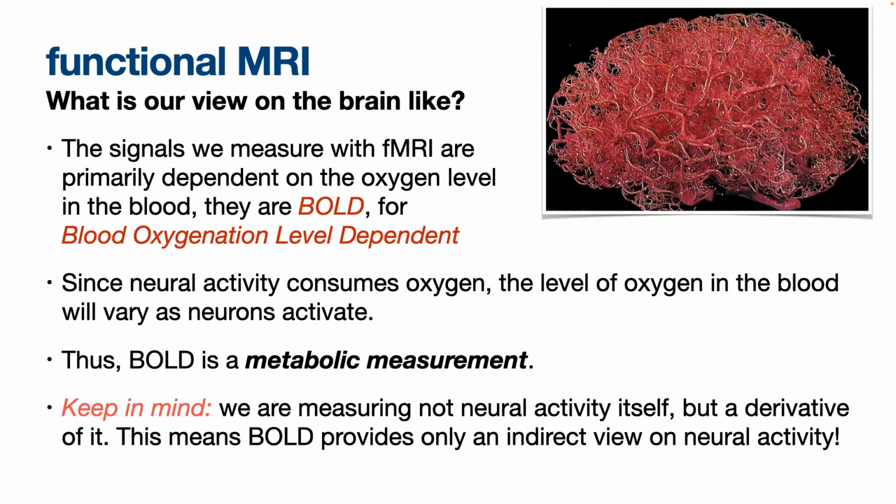And usually in a postmortem brain, it's just a part of the brain that you're scanning. So you can get really, really precise. And that's also a big benefit, that people don't move, right? So, yeah. You had a question? So what is MRI measuring, if not blood? You take it of a knee, for example. What are you actually measuring?